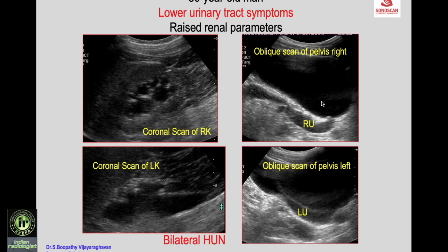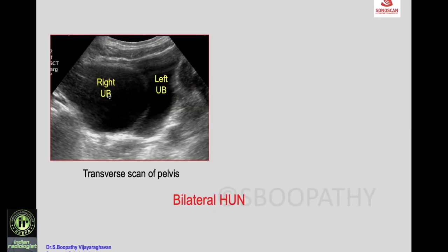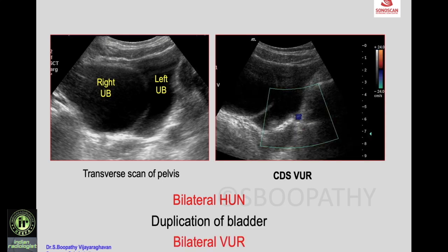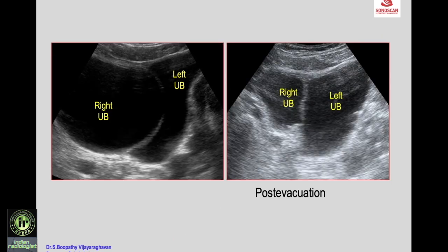Coronal scan of the right kidney shows mild hydronephrosis, and the left kidney shows an atrophic kidney with irregular parenchyma and gross hydroureteronephrosis. Scan through the bladder shows both lower ureters dilated. Transverse scan reveals two bladders of asymmetric size, and color Doppler demonstrates bilateral vesicoureteric reflux.